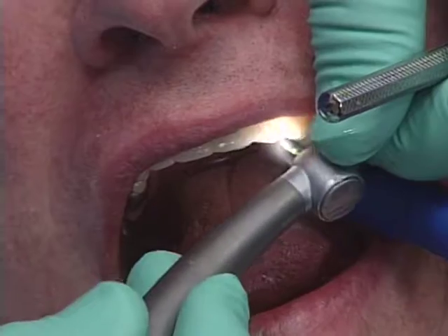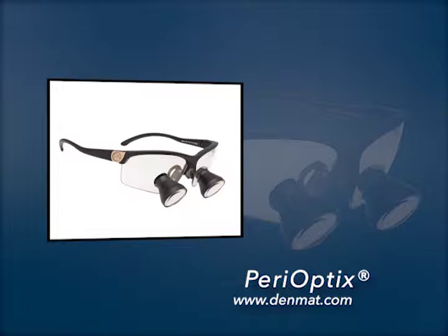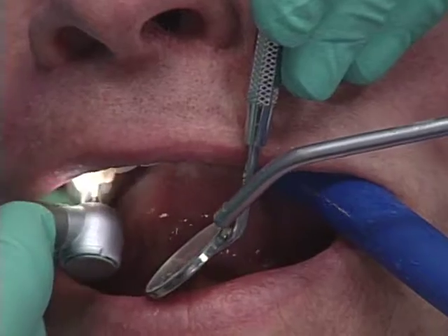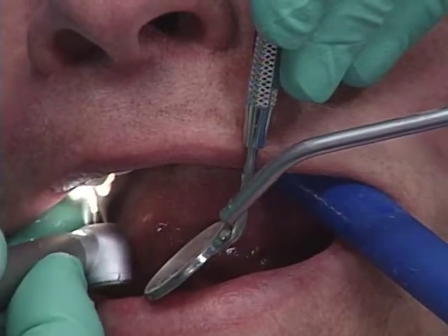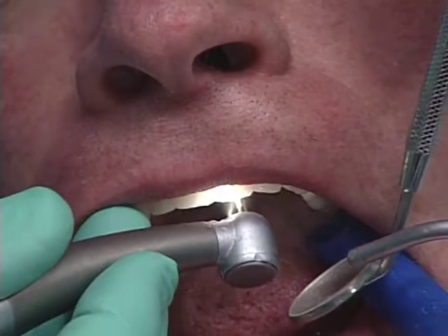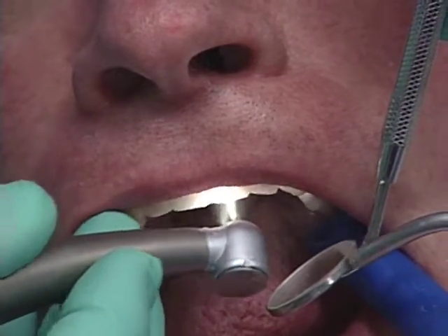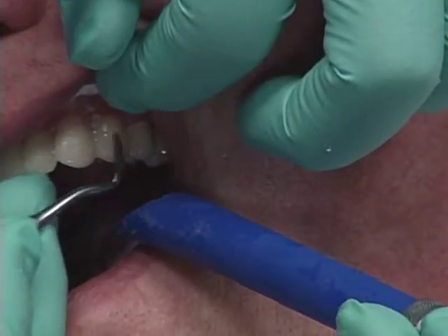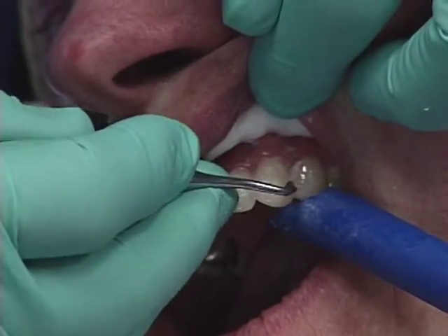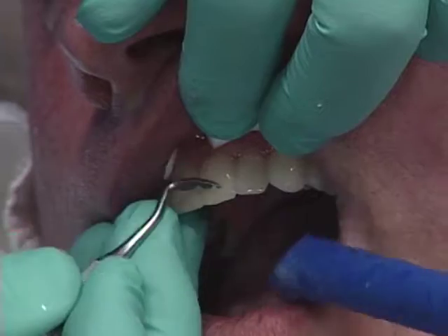All of these instruments are in the Lumineers finishing kit. I'm just blending — and this is where four-power magnification is so important. If you had treated the surface of the teeth first with etching agent and Tenure, and then put the paint-on Dental Dam on it, it would bond pretty securely to that surface, which you don't want. Now I'm using the Sher 349 instrument; we checked the margins this morning and they all fit on the teeth.